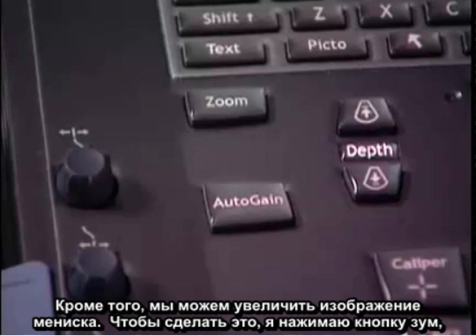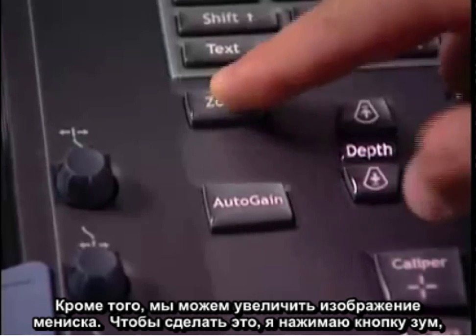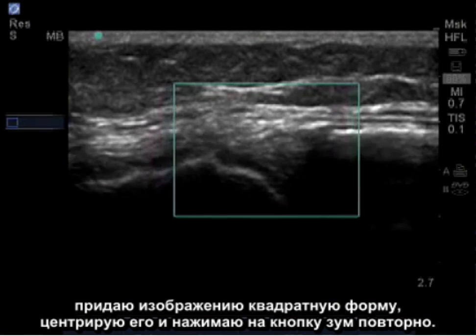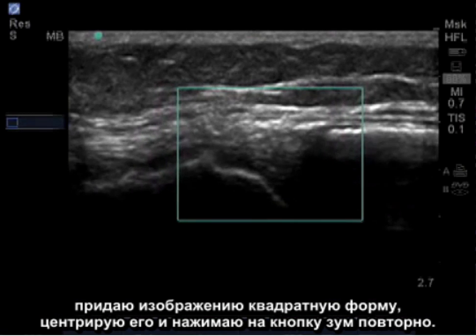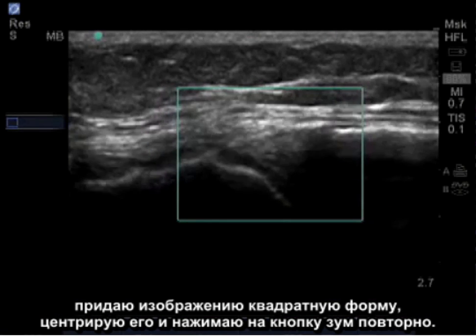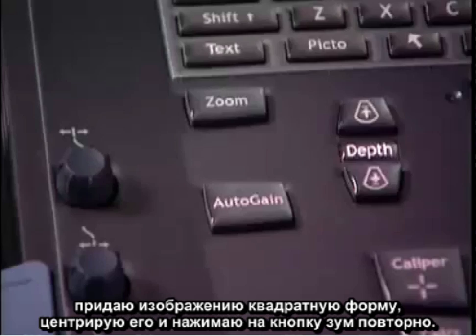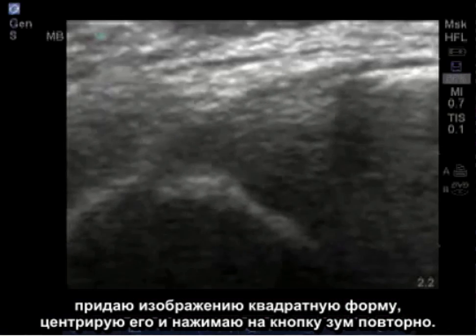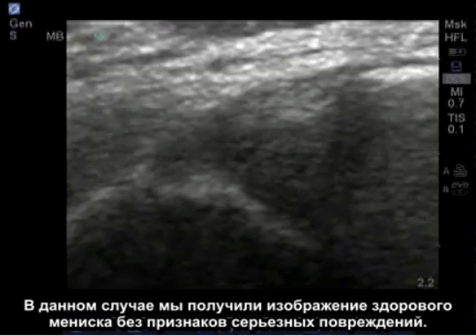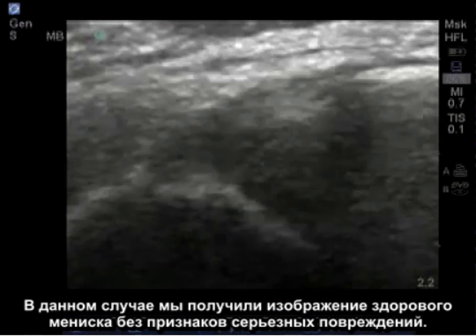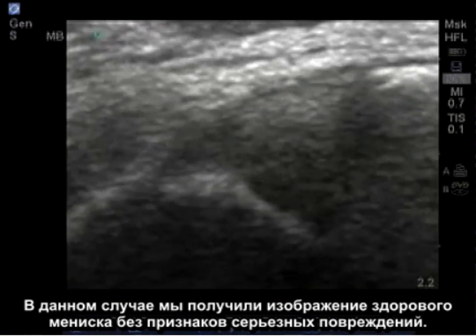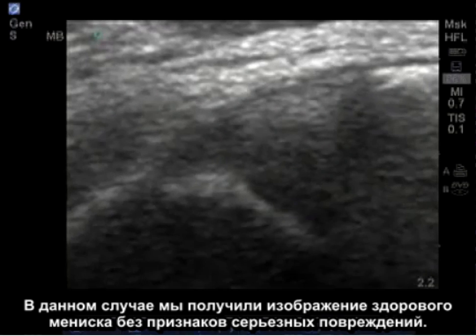I do this by pressing the zoom button, squaring the image, centering it, and pressing zoom once again. Here I visualize the meniscus, which appears healthy with no significant trauma.